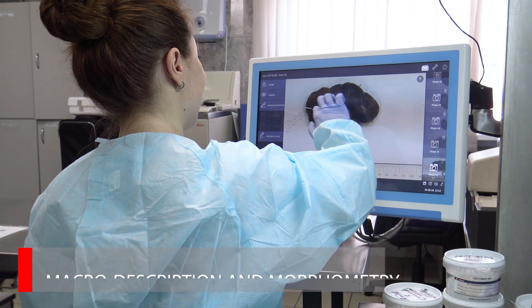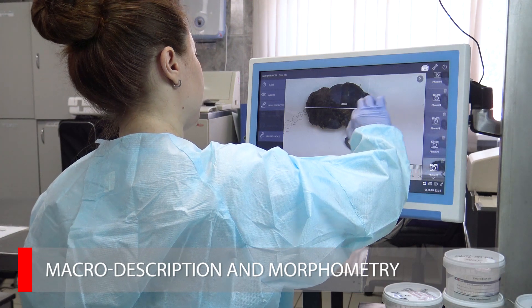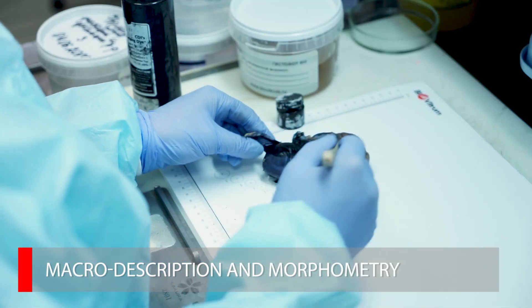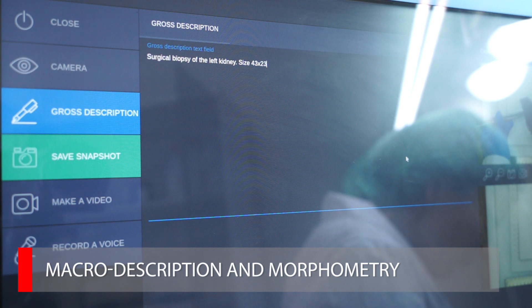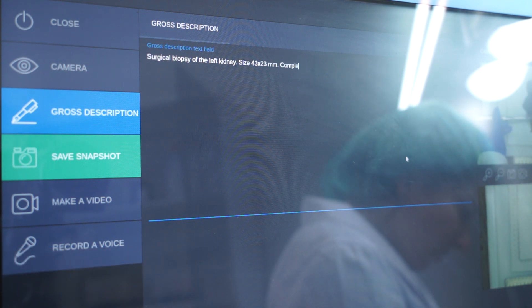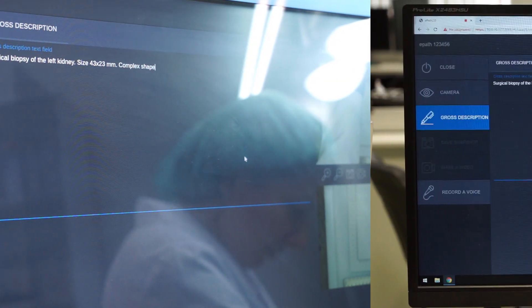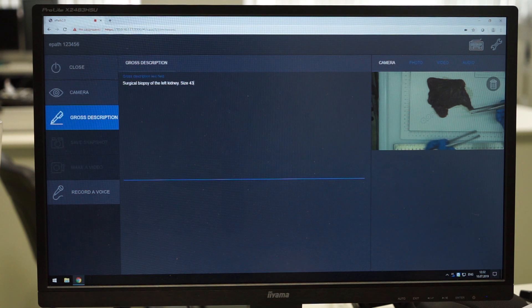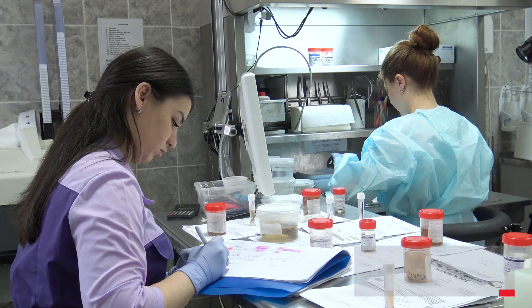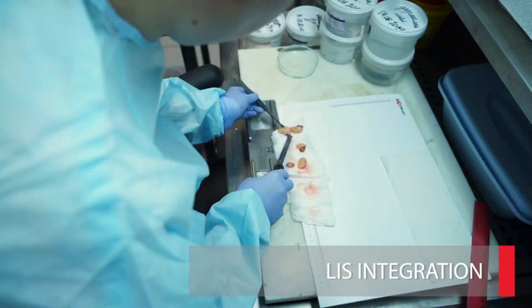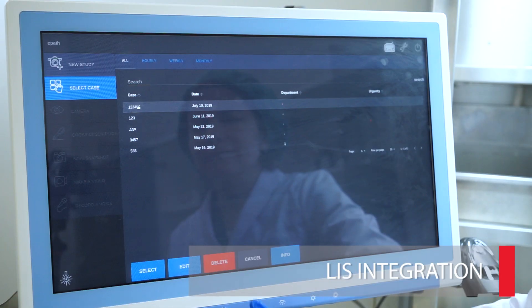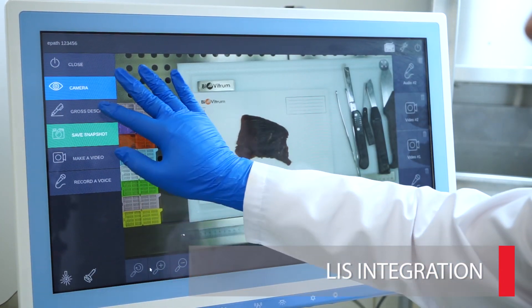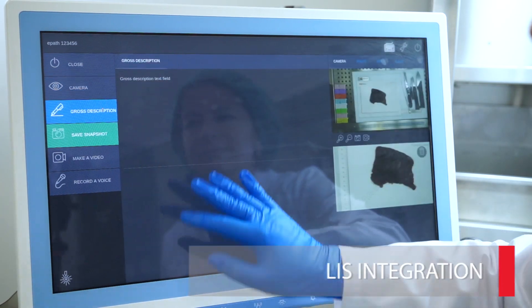ePath2.0 allows you to make a macroscopic description of the object and carry out morphometry. During the grossing, the laboratory technician enters the description into the system. The pathologist also has the opportunity to make changes to the description from his workplace. ePath2.0 can be integrated with the laboratory information system, and all information about the case is loaded into the LIS.